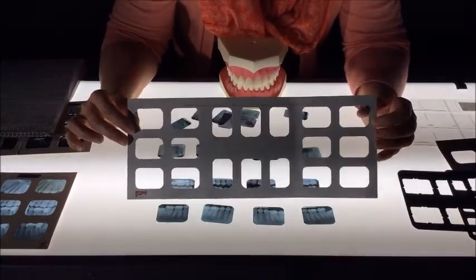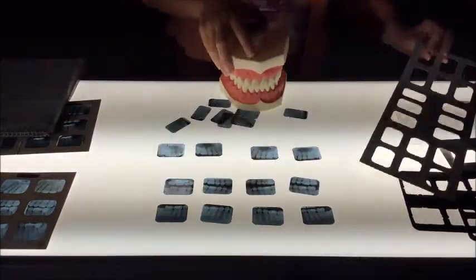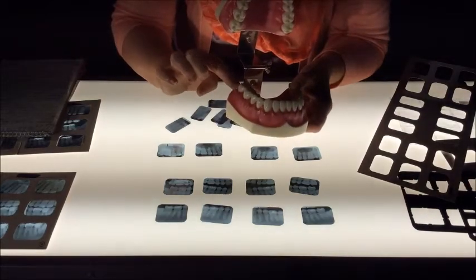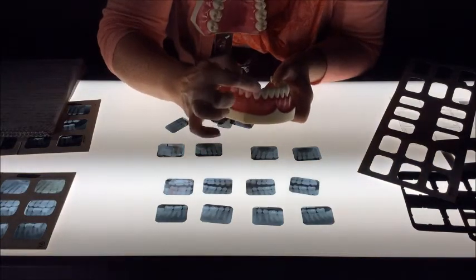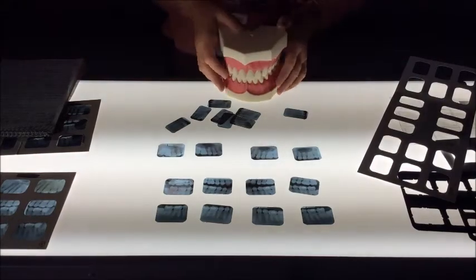right molar. When you look at your films, the molars should also be able to show, just like your anatomy, some of the distal bone in the back on a molar view, whereas a premolar view is going to show more of that pointed canine appearance, whether it's top or bottom.